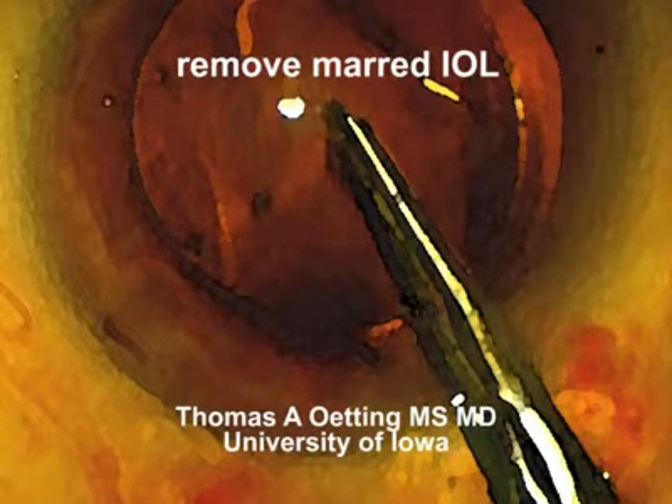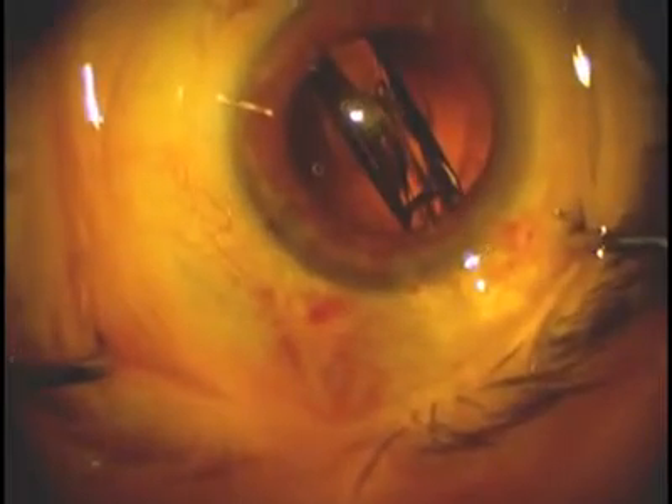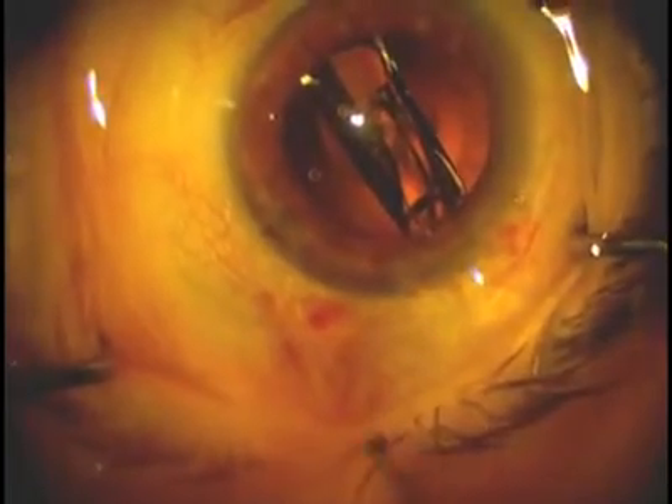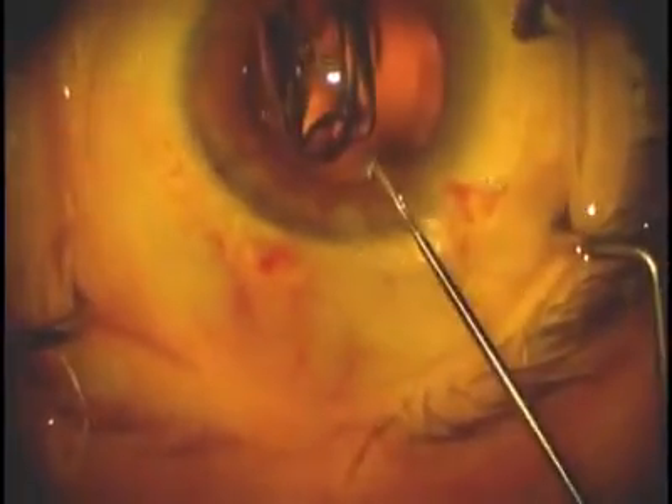Hi, this is Tom Oding at the University of Iowa. I'm going to show you a case we did a couple weeks ago where we placed an SN60WF lens, and the single piece acrylic lens seemed to be going just fine. The lens went into a nice position. Both of the haptics came along nicely. But as the lens began to unfold, we noticed there was a central mar of the intraocular lens.